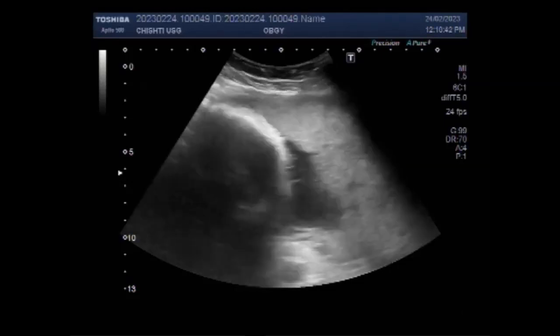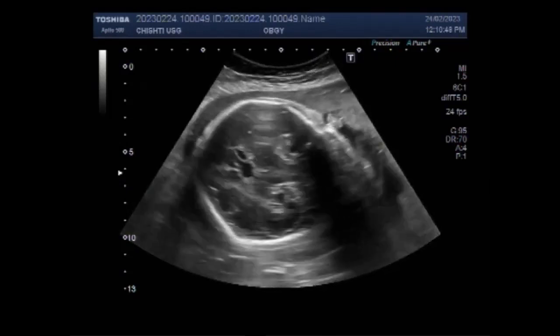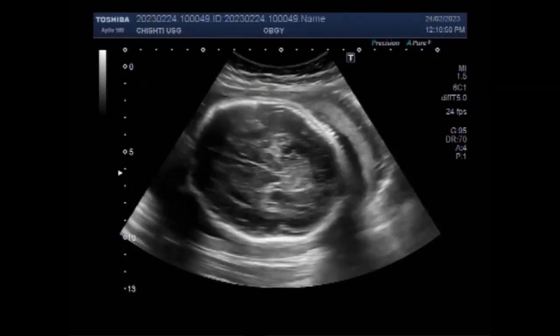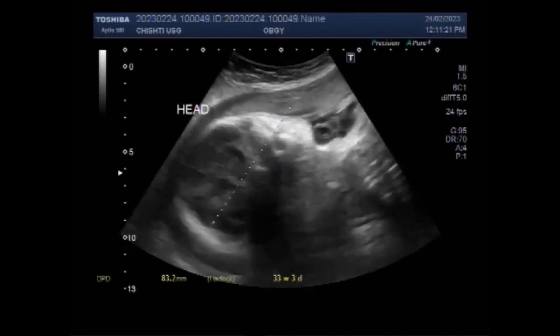Fetal ultrasonography is the most important tool to provide prenatal diagnosis of fetal anomalies. The standard obstetric ultrasound examination includes documentation of arms and legs. A congenital limb defect is when an arm or leg doesn't form normally as a baby grows in the uterus. The exact cause of congenital limb deficiency is often not known. Certain things may increase the chances of a child being born with such a defect. These include gene problems or exposure to some viruses or chemicals.